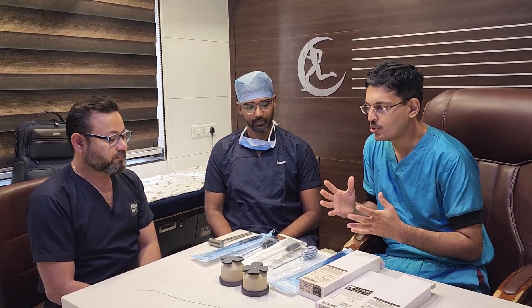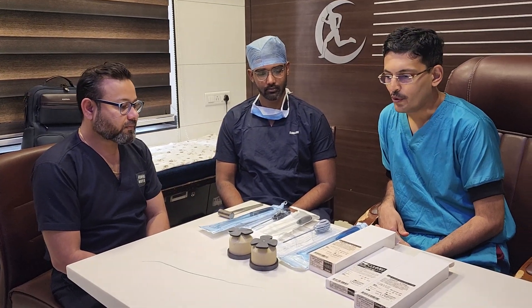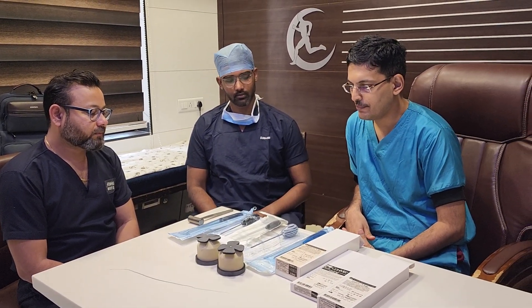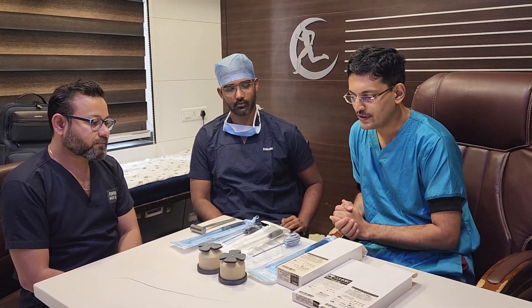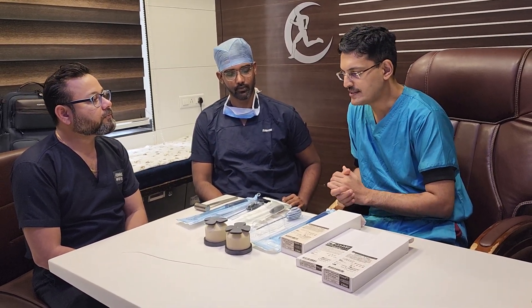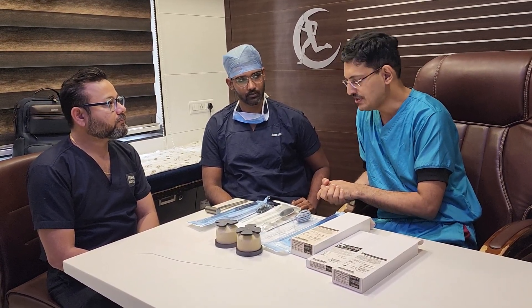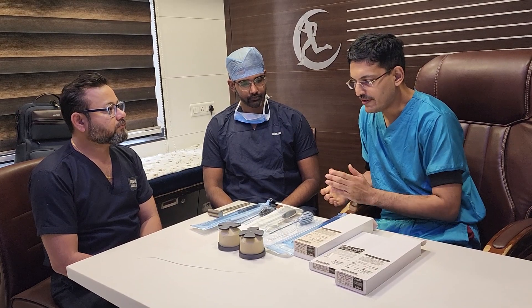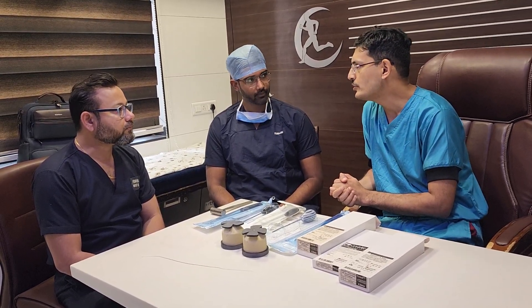Today we are discussing the rotator cuff portfolio of Conmet Linvatech. Conmet Linvatech is one of the pioneers in rotator cuff repair anchors and they have made some very good innovations which have made rotator cuff repair very easy. We will go through the anchors one by one, covering the pros and cons and how these anchors should be used.